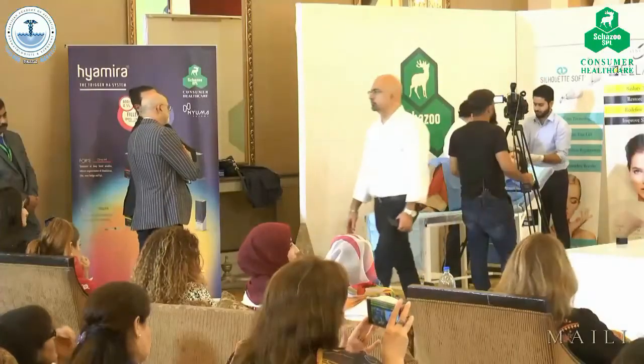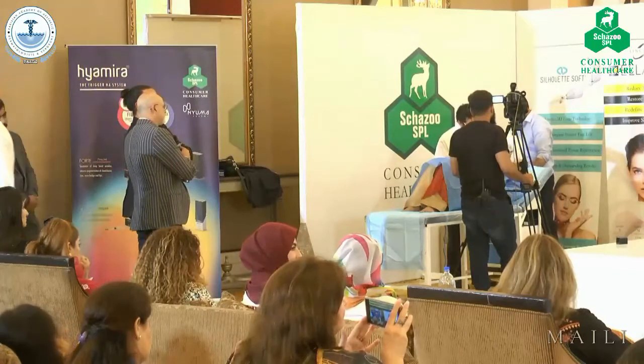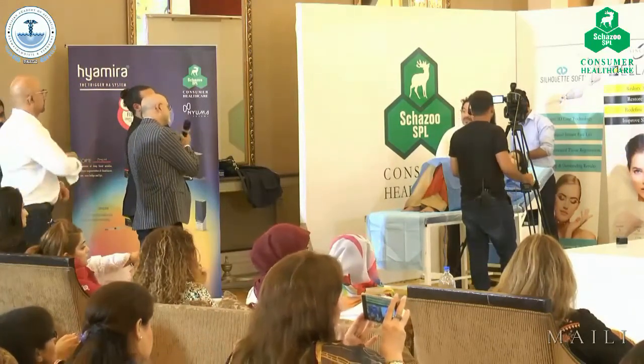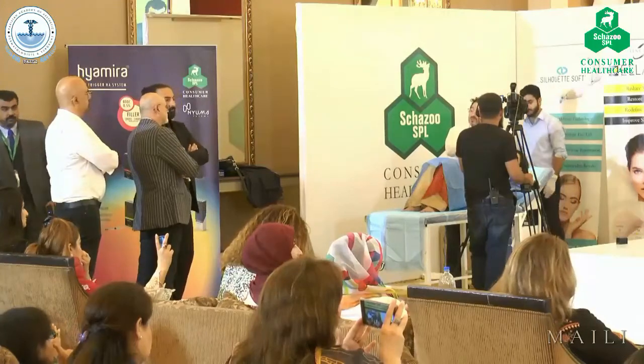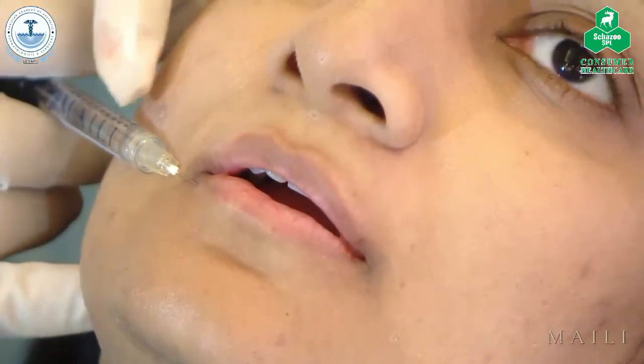Sometimes people inject 2 bolus just below, from the lower side of the lip to the upper side. Yes. One here and one here to create the tubercle. Yes. You can come from that. Okay. I prefer to go from the mucosa. That's what I'm going to do now. Okay, so I just want to highlight a little bit the contour here.